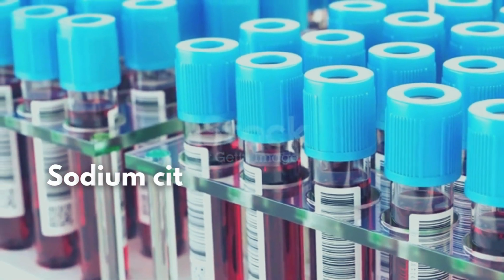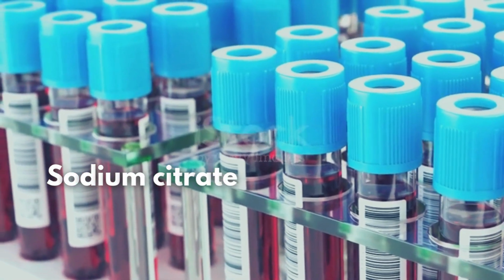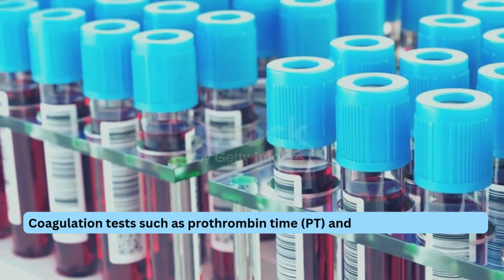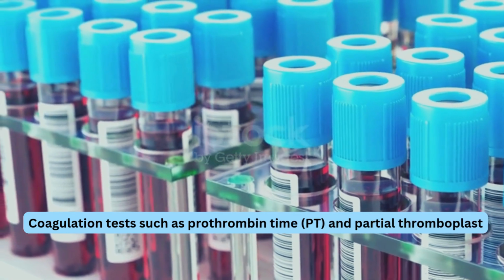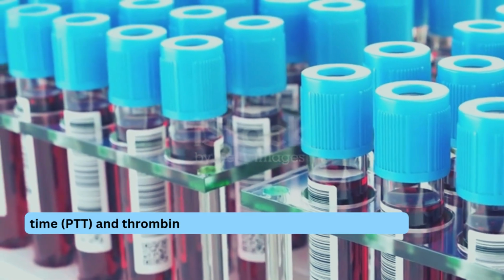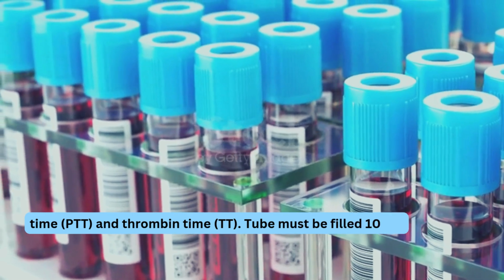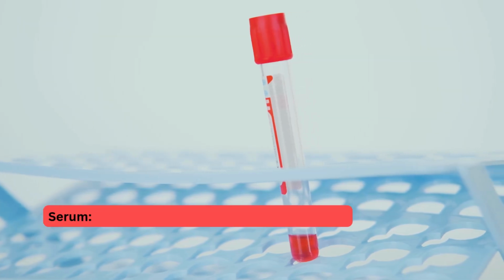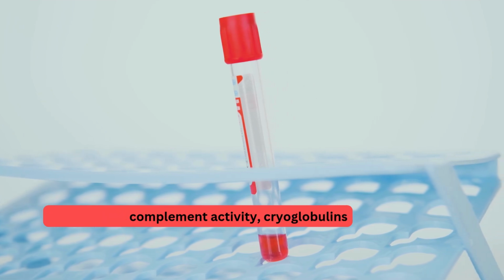Sodium citrate, weak calcium chelator, anticoagulant additive is used for coagulation tests such as prothrombin time, PT, partial thromboplastin time, PTT, and thrombin time, TT. Tube must be filled 100%. No additive tube is used for serum, total complement activity, cryoglobulins.